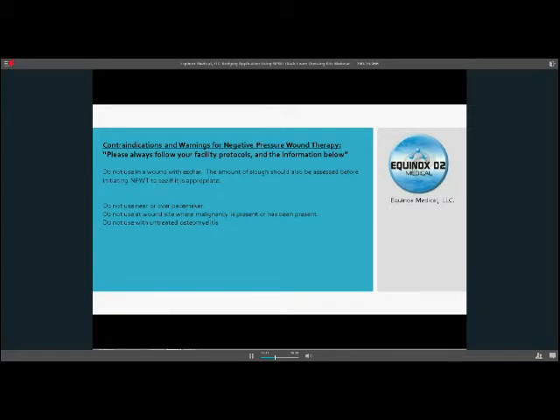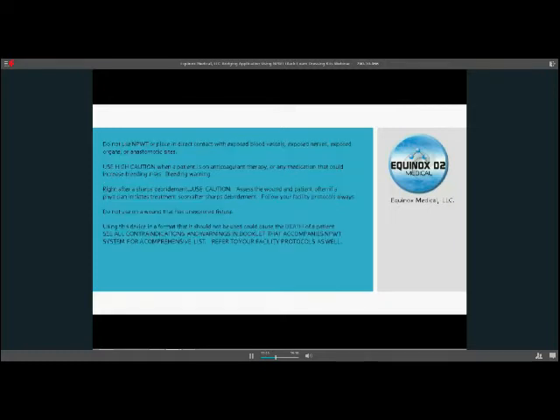You do not want to use it near or over a pacemaker. You do not want to use it in a wound where any malignancy has been present. So if a patient was to have cancer in another area of their body, then it may be appropriate at another site. Maybe they have a sacral wound or something like that from a pressure ulcer. That's okay, but if there's actually been a malignancy removed from that area, you would not want to start proliferating those cells again. You do not want to treat with any untreated osteomyelitis. You want to look at that and have that treated.